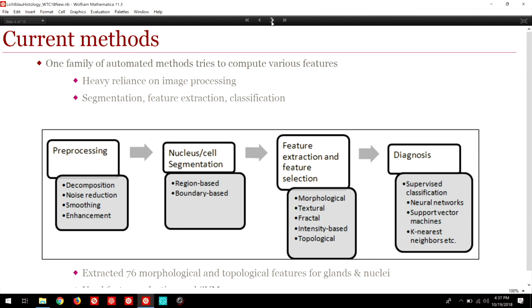And we could say that actually BreakHis represents 4 different classification problems, because it contained 4 different data sets of different magnification levels: 40 times, 100, 200, and 400, and each one of these was actually larger than the other data sets we had. So this is a very large data set that is available. Actually, all these data sets are available for download if someone wants to go and test them.